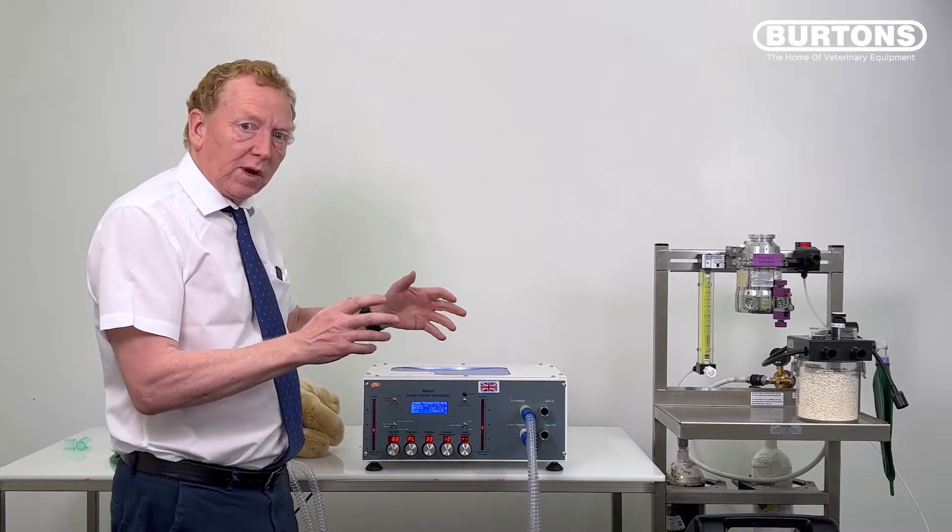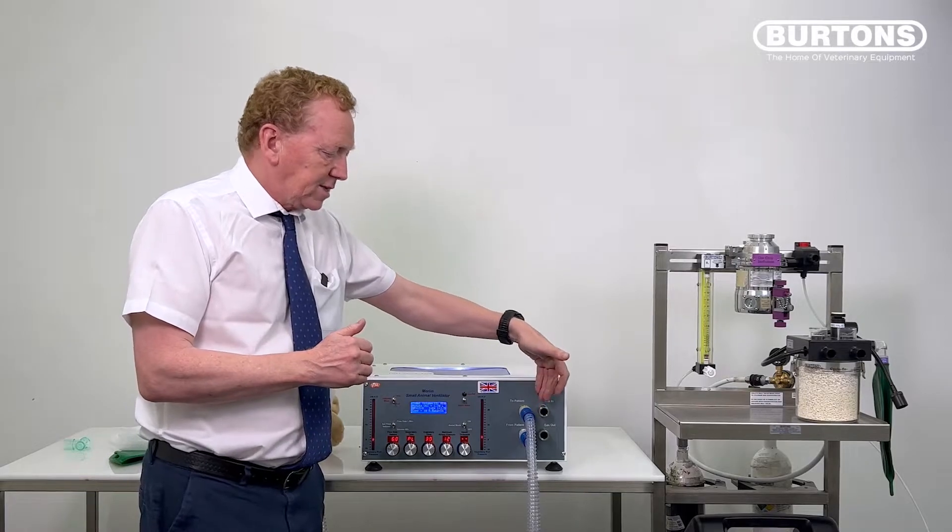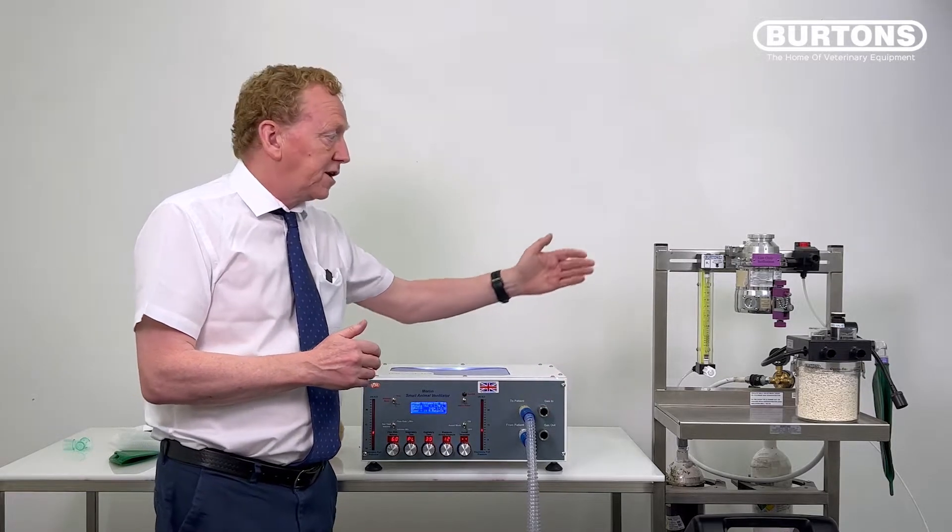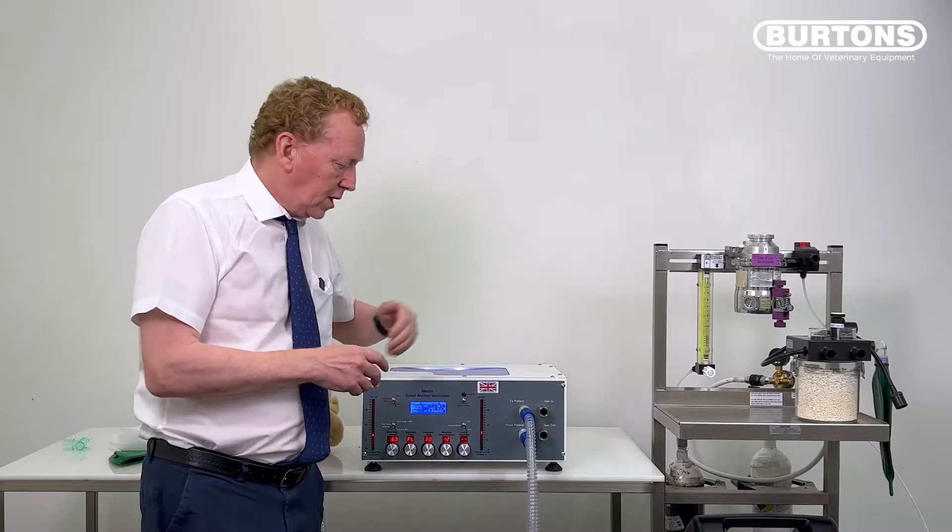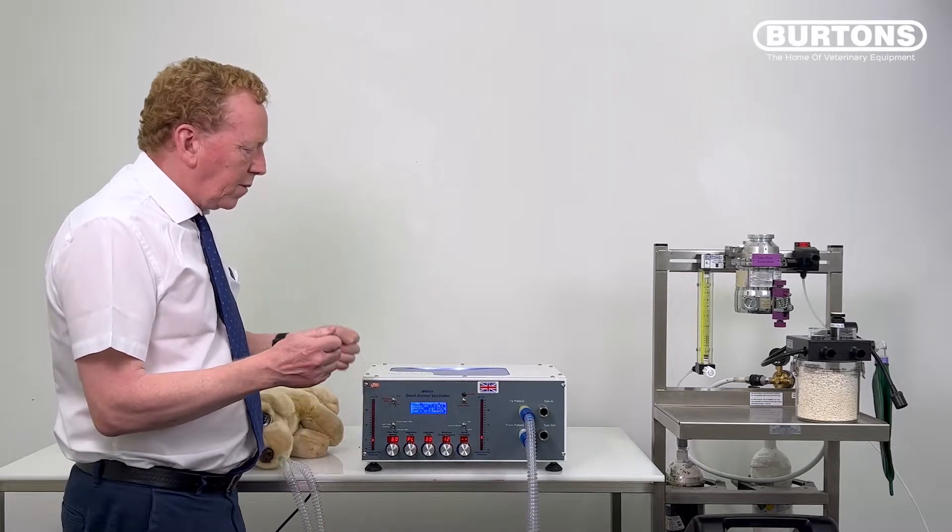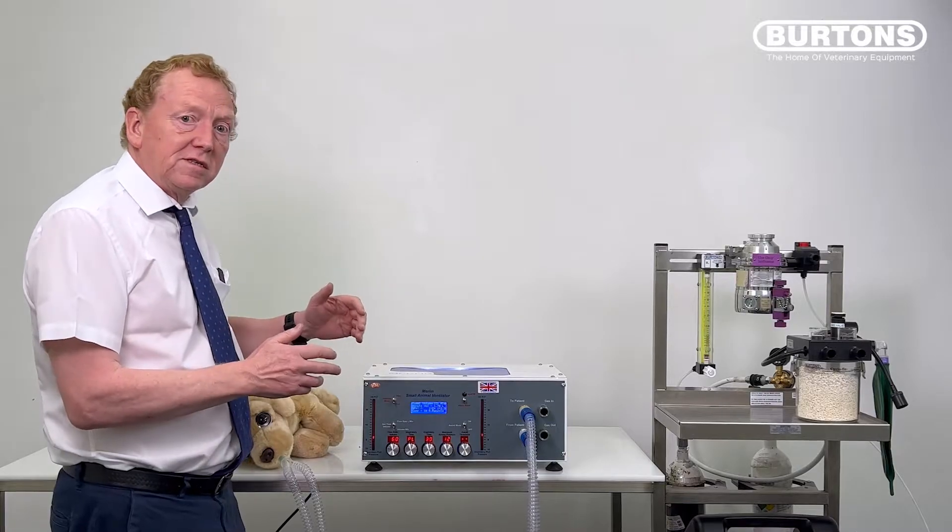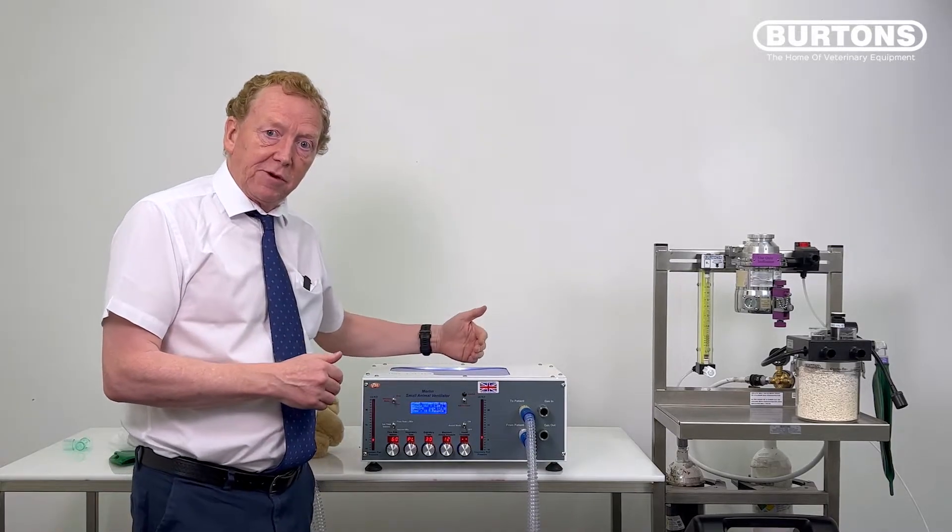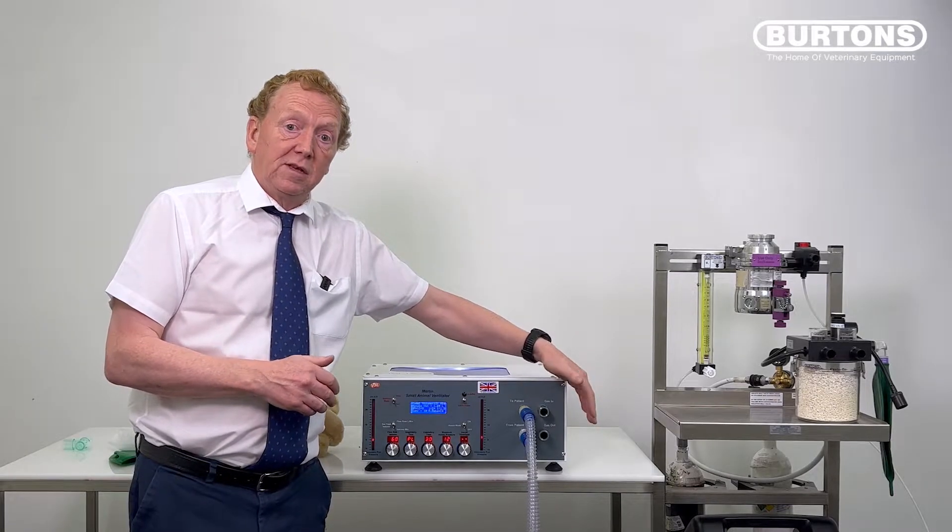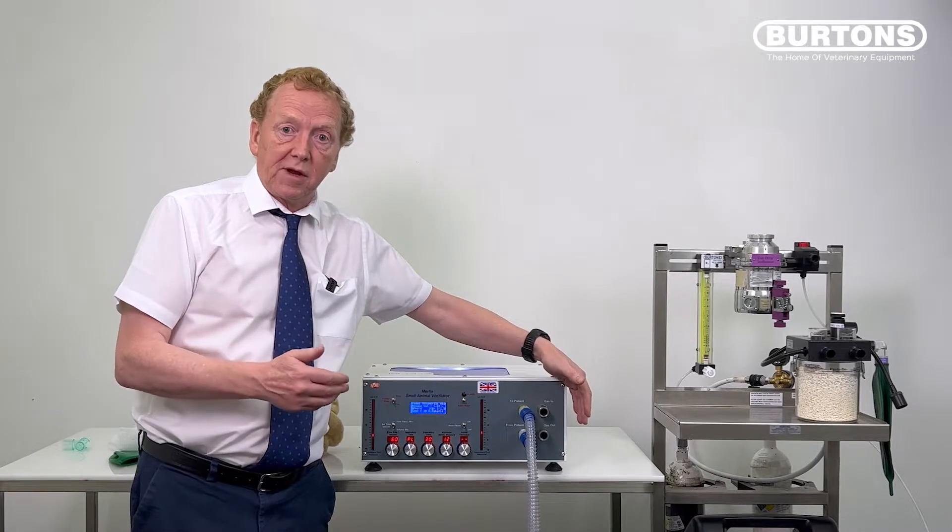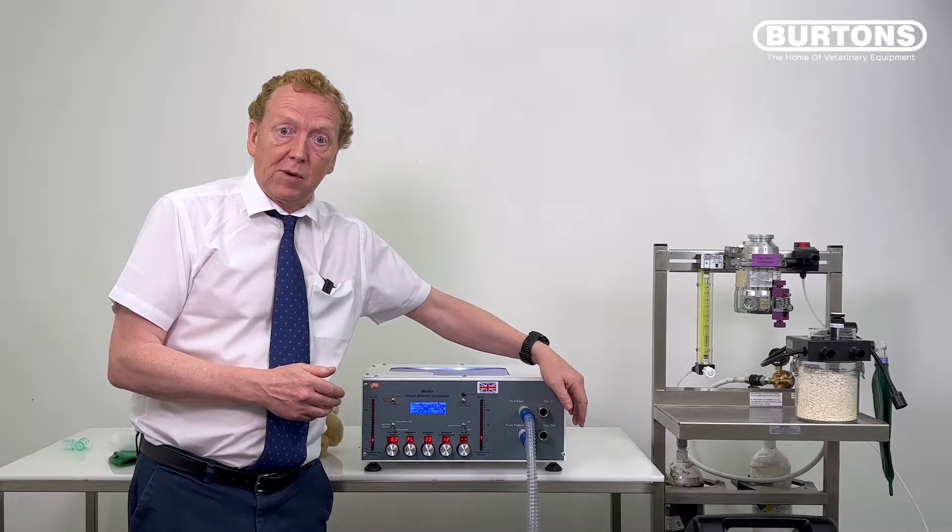So we have a period then when the gas inlet is actually closed off and that has implications if we're feeding it from the fresh gas outlet of an anaesthetic machine. So I just want to show you what will happen if we, in the first instance, prevent Merlin from filling up the gas in the expiratory phase. So I'm going to put my hand over this gas in port, just occlude it and see what happens. And I suspect we're going to find we get a nasty gas inlet blocked message.